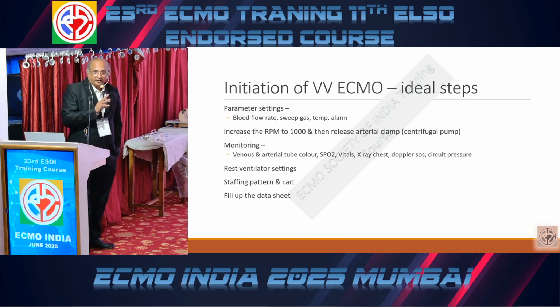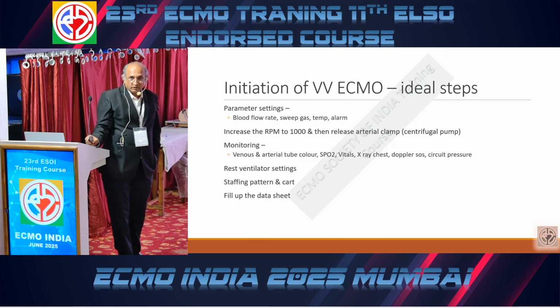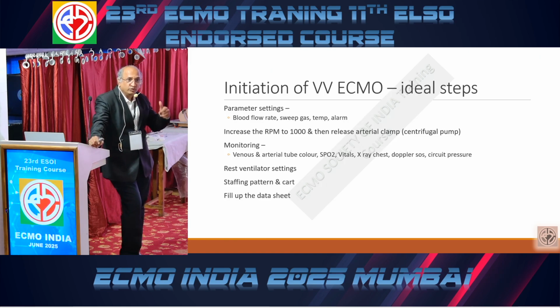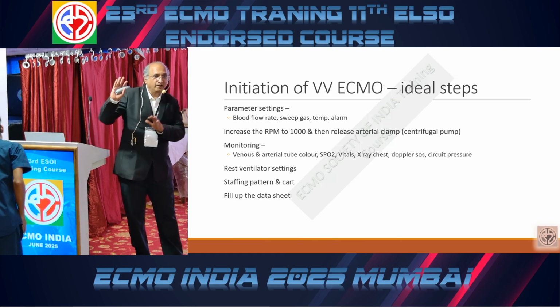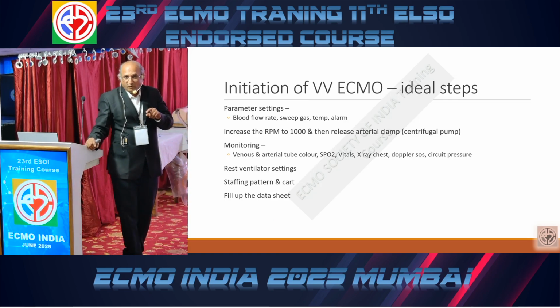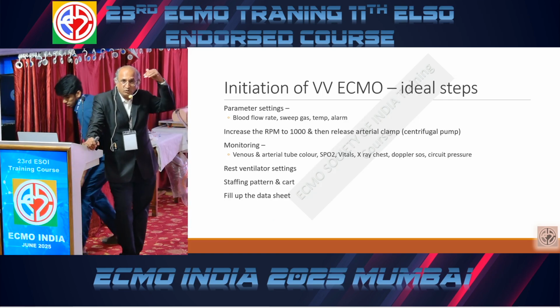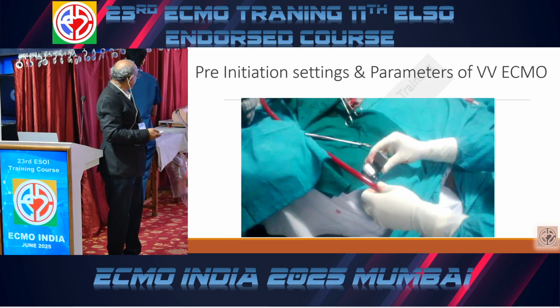Come down to the rest ventilator setting for VV ECMO, and for VV ECMO, inotropes should come down. Your job does not get over once you initiate ECMO. I always say during lectures, go to rest after the ventilator goes to rest. When you start ECMO, it's not that you go immediately, "chalo ECMO ho gaya, now residents will manage." No, you have to start ECMO, let it reach your target flow, let the rest ventilator setting come, and then you leave. Okay.